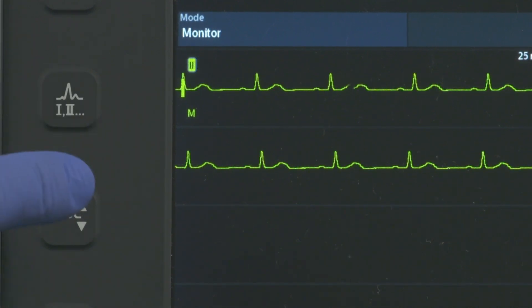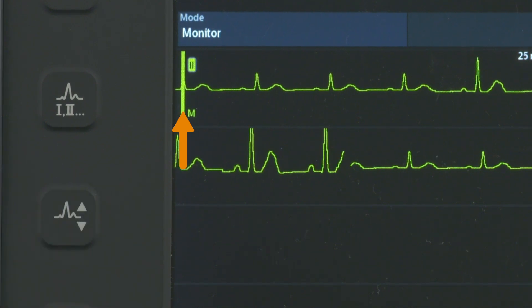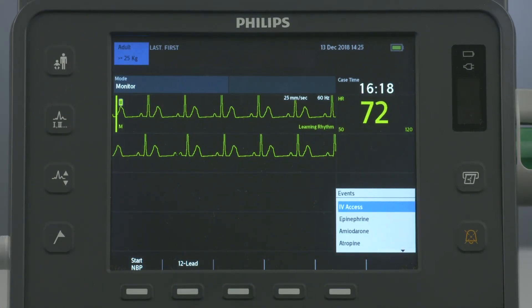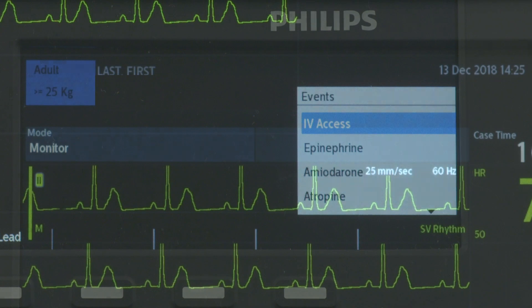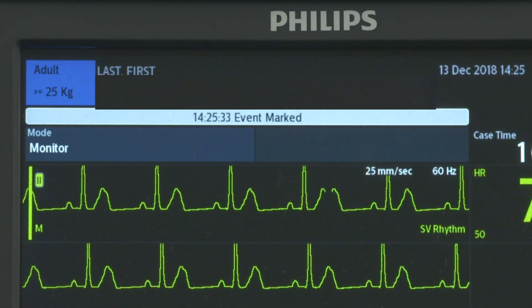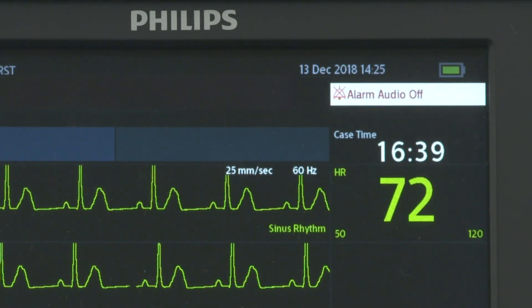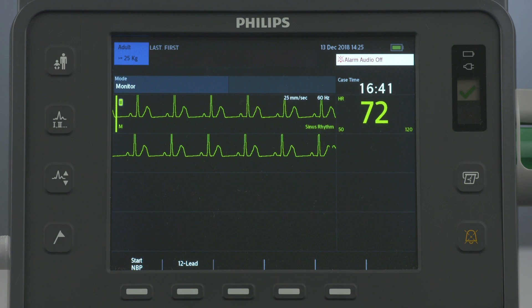The ECG Gain button increases the ECG waveform vertical scale of the primary lead by one setting. Press the Mark Event button to insert a time-stamped annotation on the ECG strip and in the Event Summary report to note events as they occur, including certain drug administration. The Alarms button pauses all audible, physiological, and technical alarms for the configured time interval; press it again during the pause interval to return alarms to their previous settings.